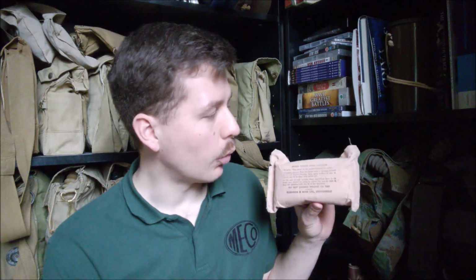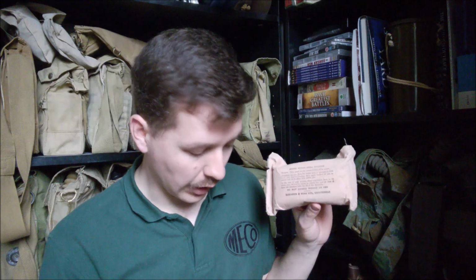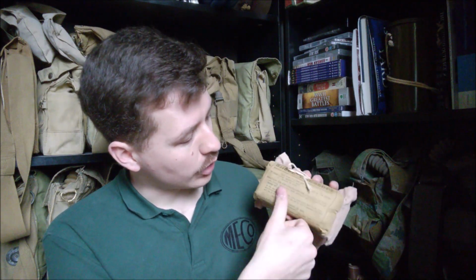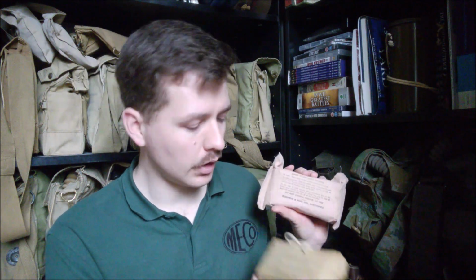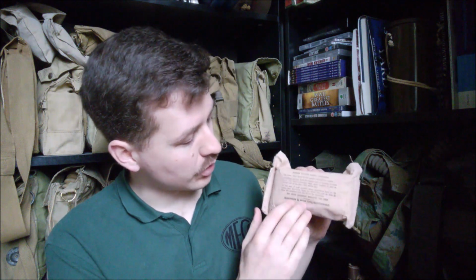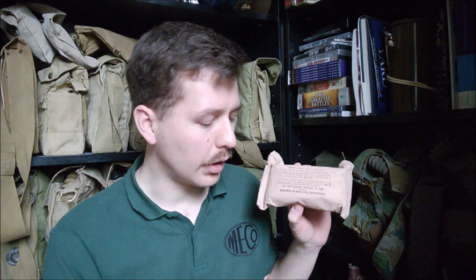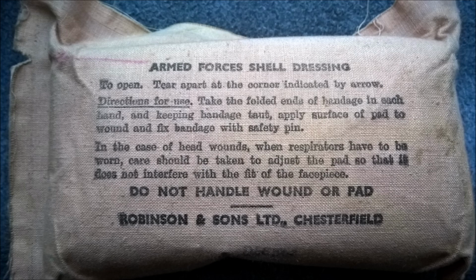And in the 1970s, the Joint Services dressing would be introduced and would begin to replace these, although obviously there are many stories of shell dressings, even of this vintage of Second War or even earlier, of this type being used in the Falklands War, and later even certainly in training. I've read of these being used into the 90s. So yeah, but this is sort of an interim design between the shell dressing and the Joint Services dressing, which came a bit later, which I will be doing a video on at some point. And here's the later type of shell dressing packaging. You can just make out the date stamp at the bottom, and again, if you wish to read the details, you can pause the video here.